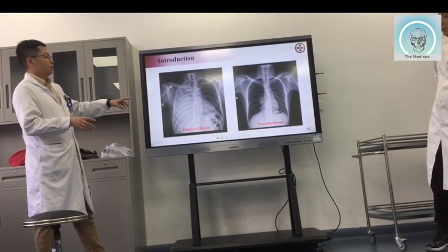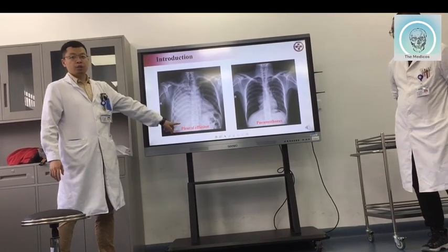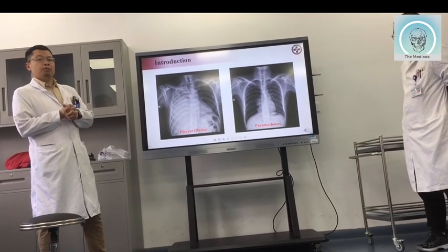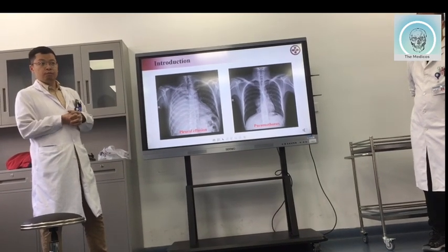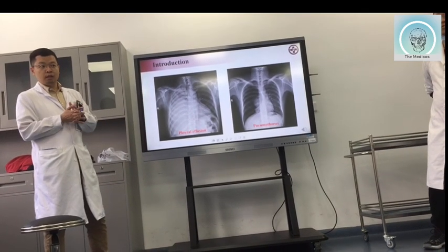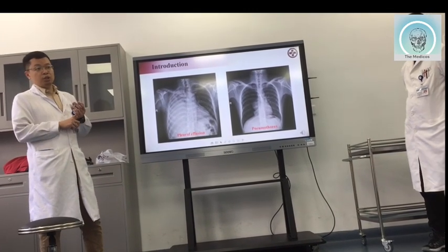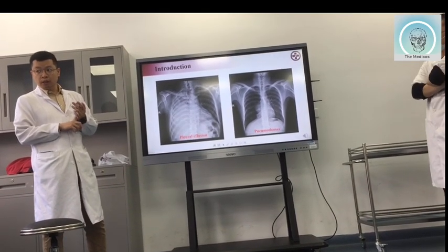You can see the chest X-ray here. We call it the pleural effusion. I hope you have already learned about this kind of disease. And there are many kinds of causes of this disease. Such as, can anyone tell me the causes of... Did not learn anything about it? No? Any causes? Such as infection, such as trauma, such as internal bleeding, and so on.